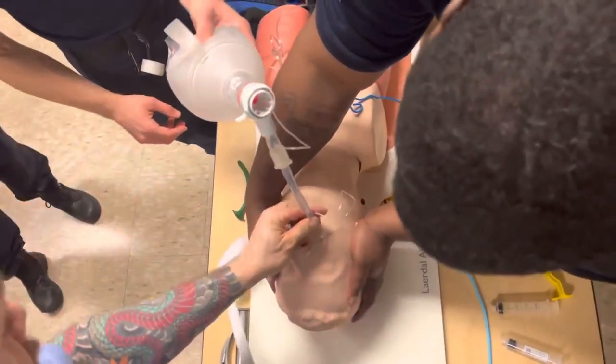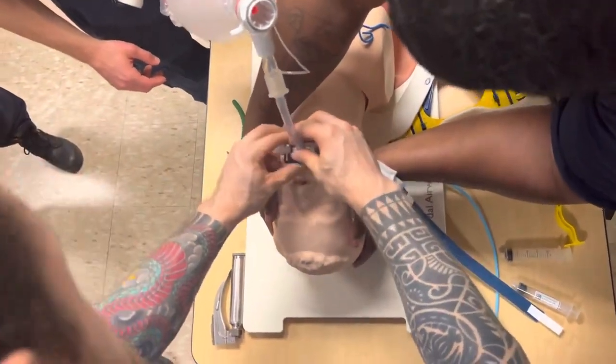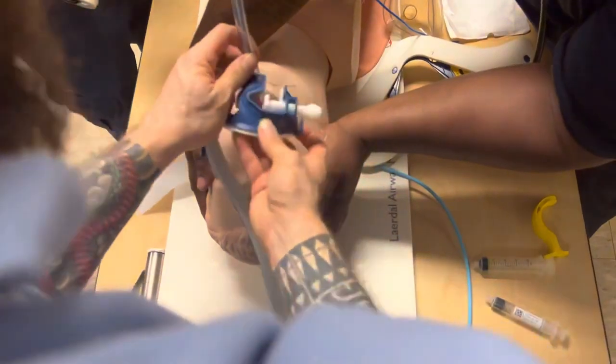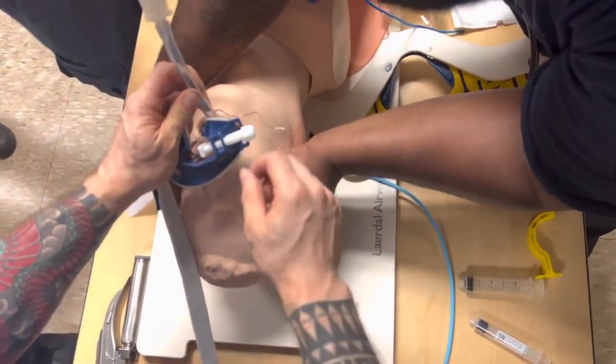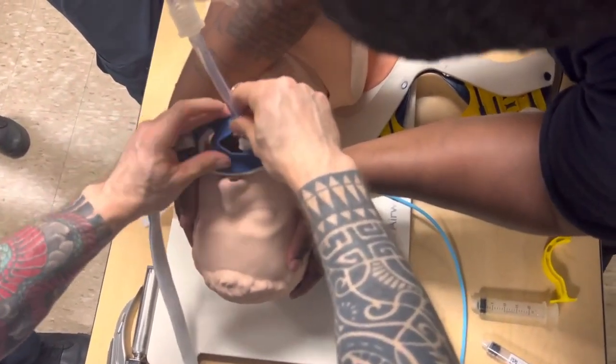So this is the bite block. One thing I see you guys doing, you place it like this. Don't place it like that. Why? Because if I want to suction, I want this opening towards the feet. Why do I want it towards the feet? Because then I could put a Yankauer in if I need to open the mouth, right? Make sense?